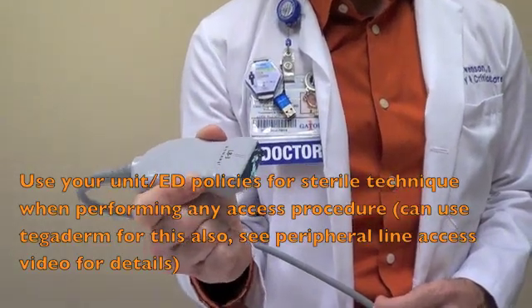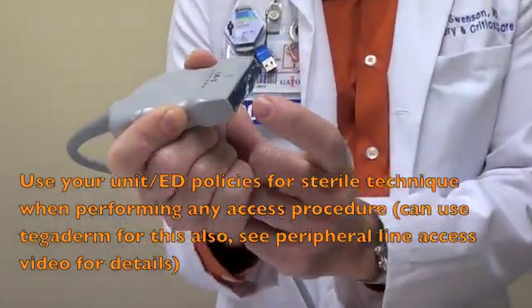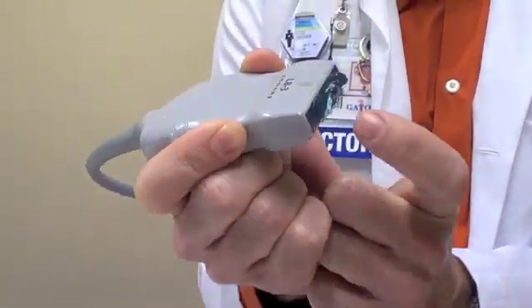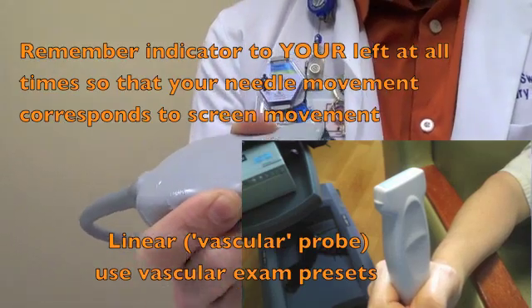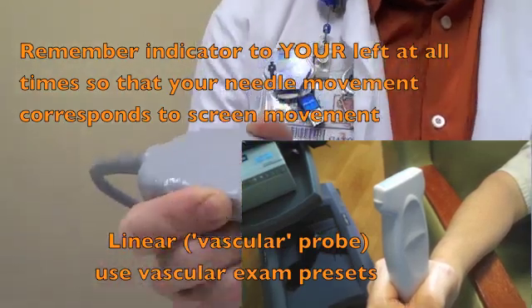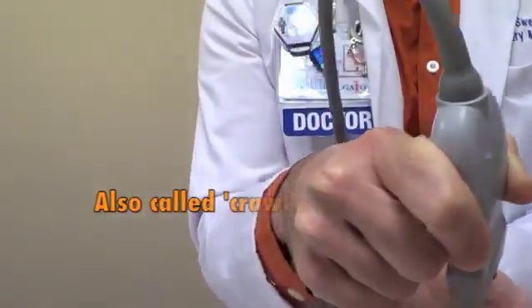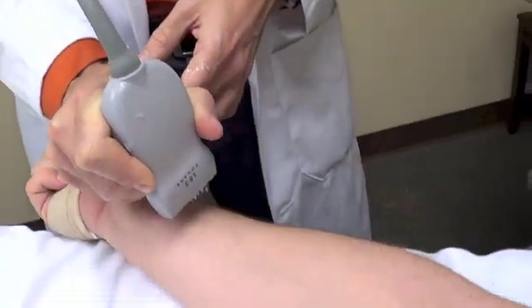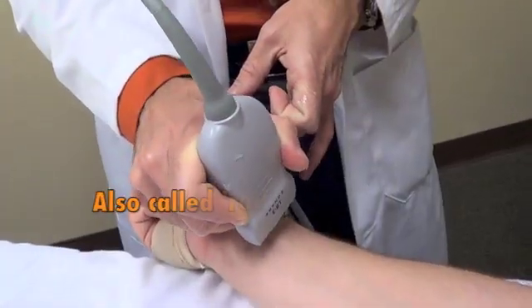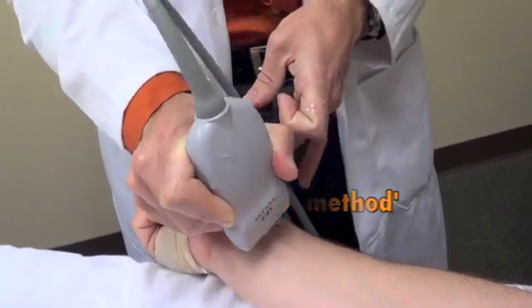For any ultrasound technique, it's very important that the sensor pad — this dark area — stays on top of or in front of your needle point at all times. In order to do that, when you advance your needle, you're going to want to slide. When I say slide up, I'm actually sliding proximal on the patient. Alternatively, one can use the rock up or rock down maneuvers.